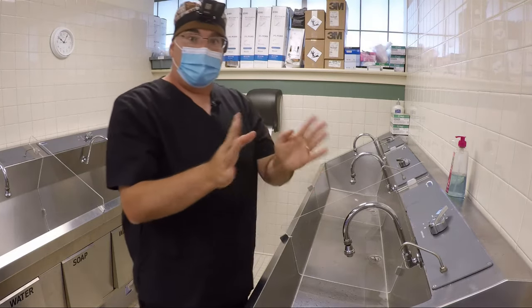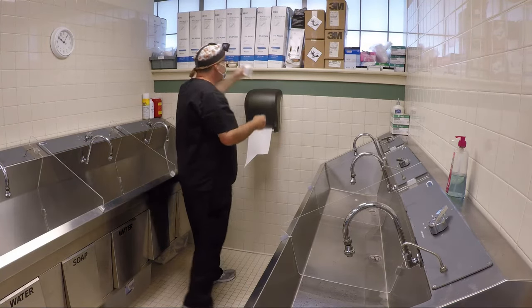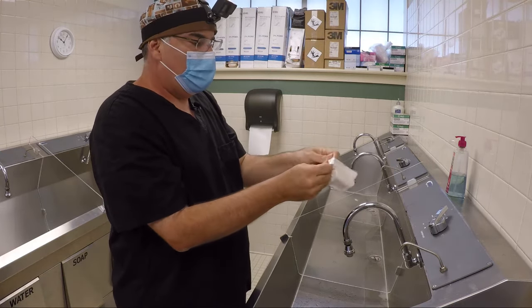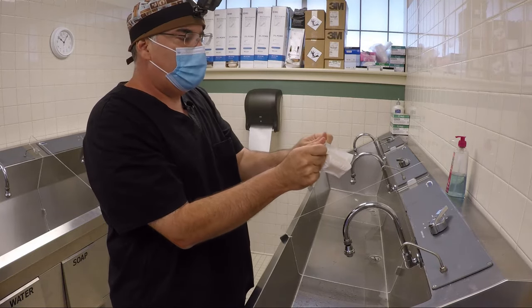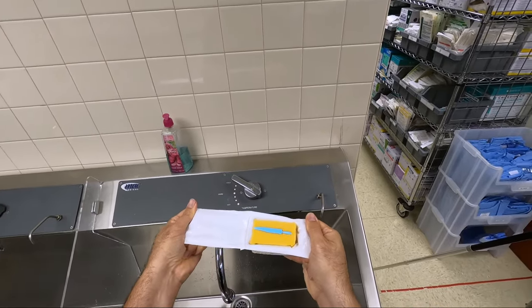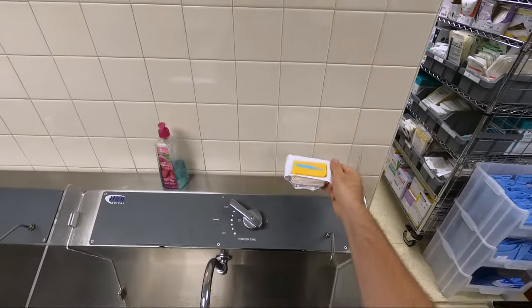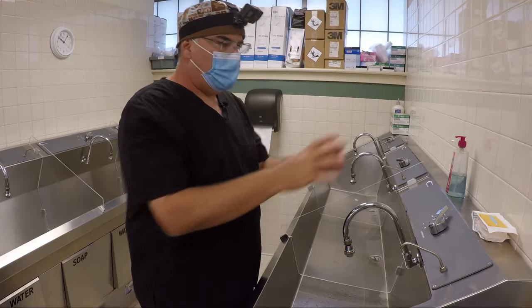All right. So to begin, we're going to get ourselves a soap scrub brush, which I have right here. Very first thing we're going to do is start by opening this. Now this is sealed, so it's nice and clean, probably sterile in there. We're going to open it up in a way that doesn't touch the inside yet. All right, we open it up to about that point where everything's exposed. We can pop that up a little bit. And then we're going to turn this underneath so that it is sitting there open. And I'm going to sit it onto the sink right there, right in front where I can get to it.